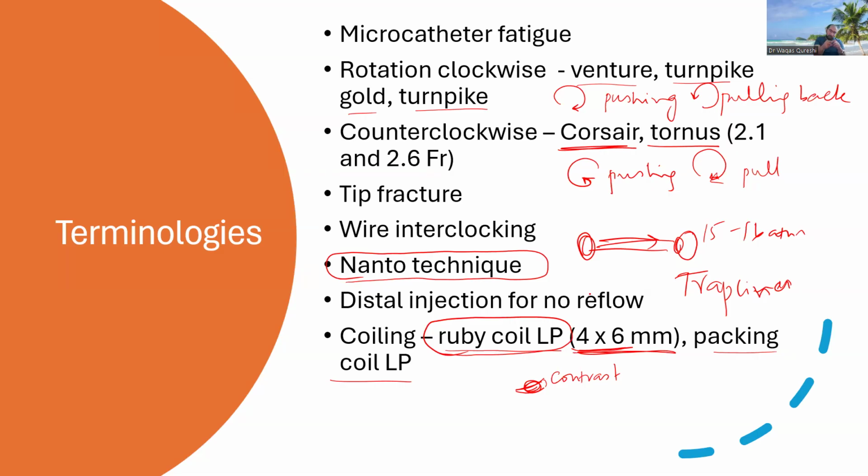Once it's injected into the microcatheter, then either with the back end of a guide wire or even the front end, you would know where, because you cannot really see it very well, but you can just see the distal end of the wire. You can push it into the location where it should be. Don't advance the back end of the wire outside the microcatheter, otherwise it will cause another perforation.